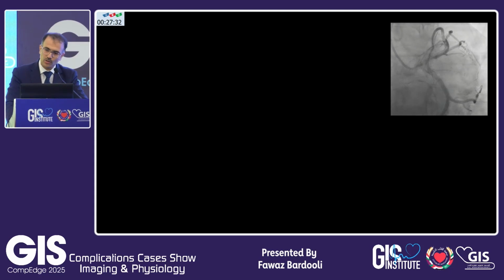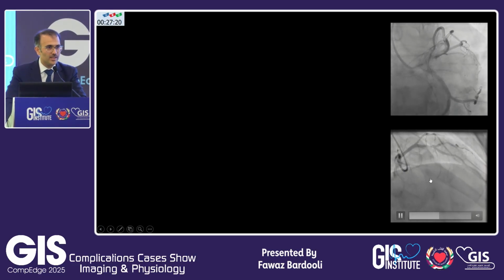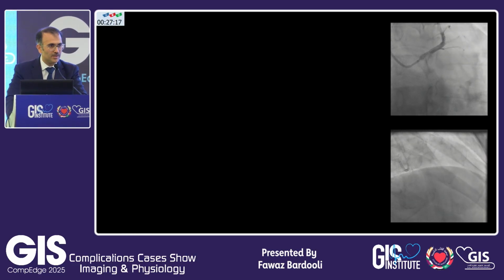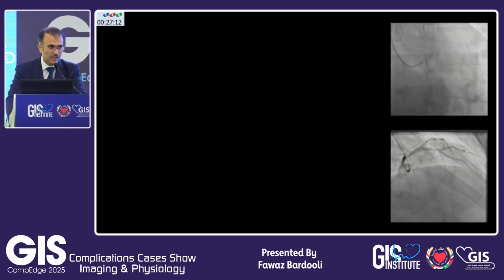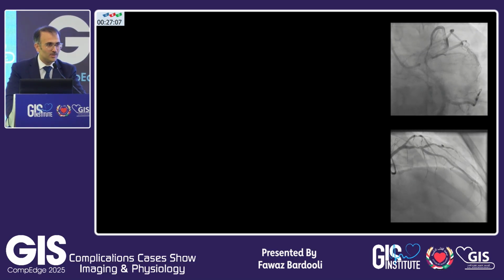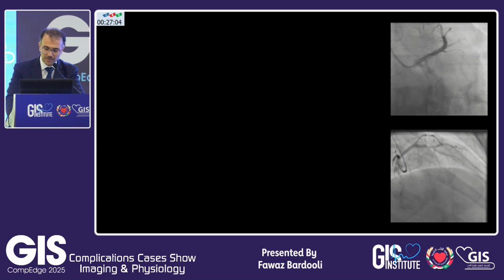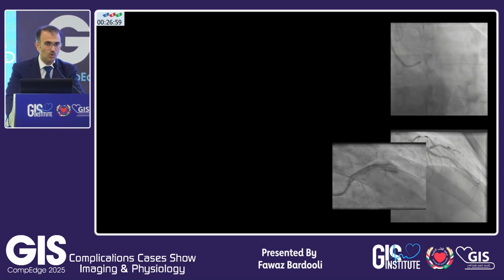All right? So is it really, should I continue stenting or should I defer? So I need something to help me with that. At the same day, you have a patient who presented with LAD diagonal like this. You think this is going to be easy and you will finish quickly. And while you are wiring the LAD diagonal, we have one lady called Sharon. She is the sister of the head cath lab. She comes and tells you there is a primary coming. I said, okay, fine. So you put the wire, you dilate, and you end up with this. Oh. Okay? So that's not going to be my day.